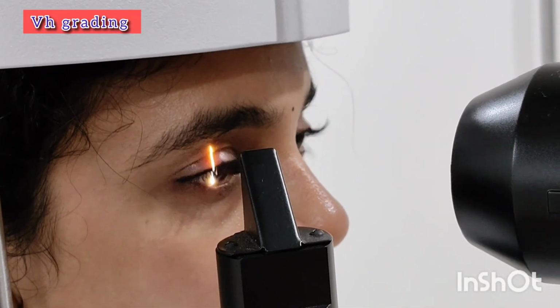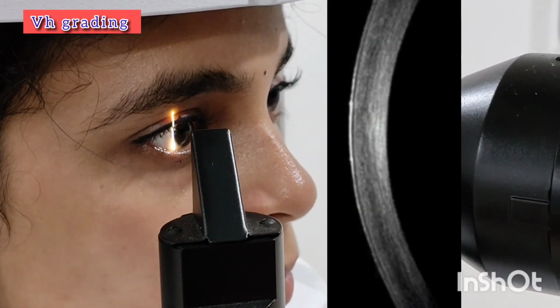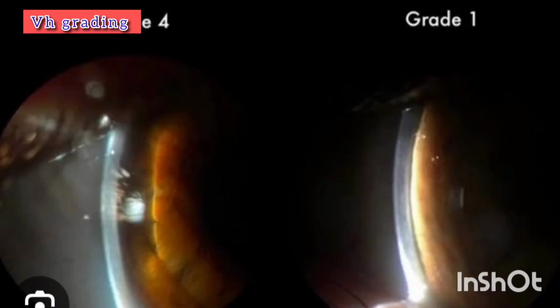Then move to anterior chamber depth examination. For that, we need to make a slit beam near to limbus, focus towards the iris and study the depth of anterior chamber.